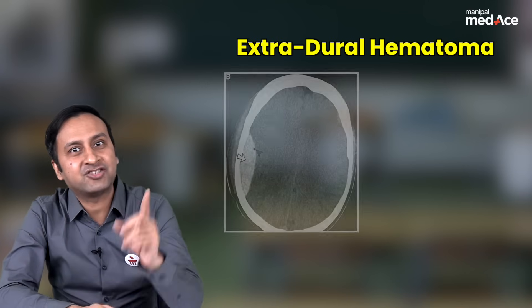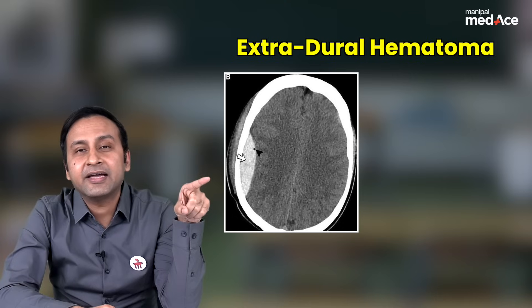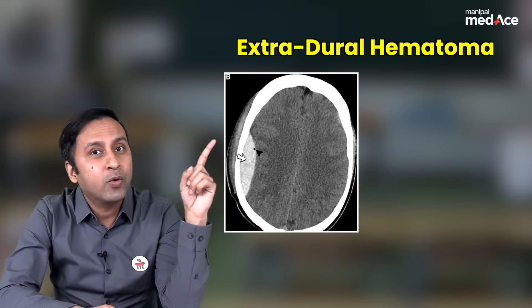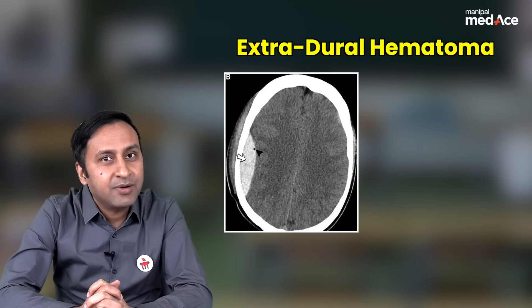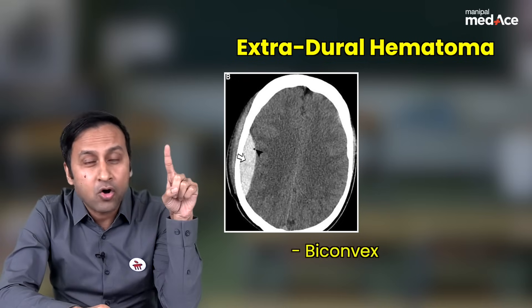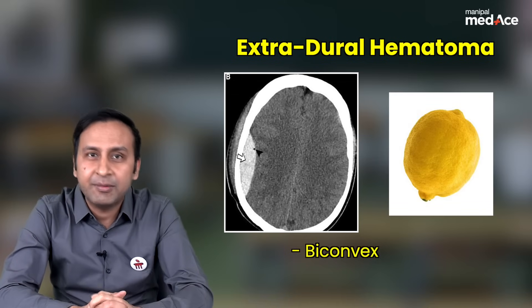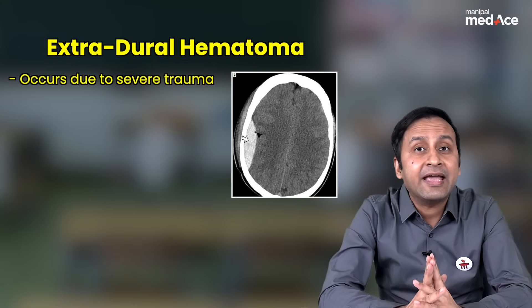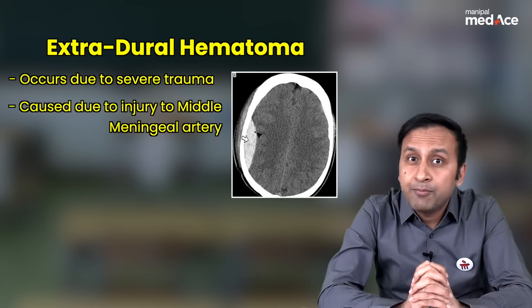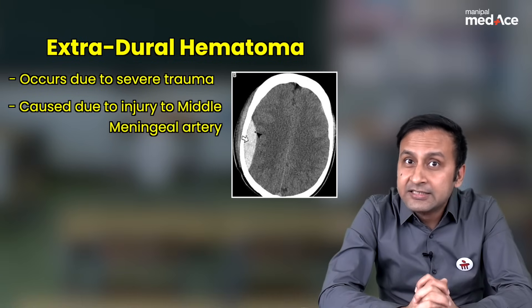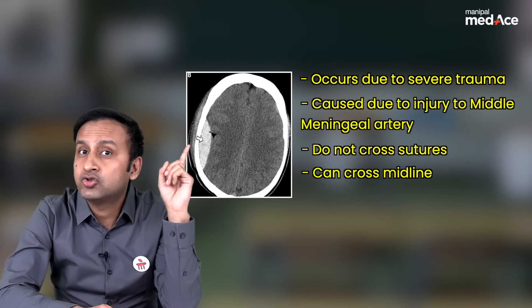Let's first talk about the extradural bleeds. Look at this particular CT. What do you see here? You can see that there is a very well-demarcated extraaxial hyperdensity over the right parietal convexity. This is a classical appearance of extradural hematoma, which takes the shape of a biconvex or a lemon. EDH occurs due to high-impact trauma and due to the rupture of the middle meningeal artery. The most important point to remember about EDH is it does not cross sutures. It may cross midline, but it does not cross sutures.